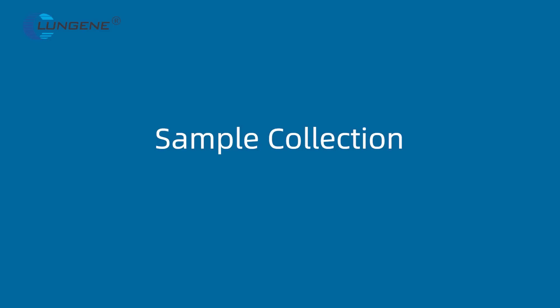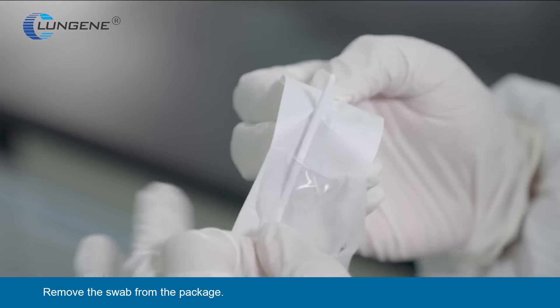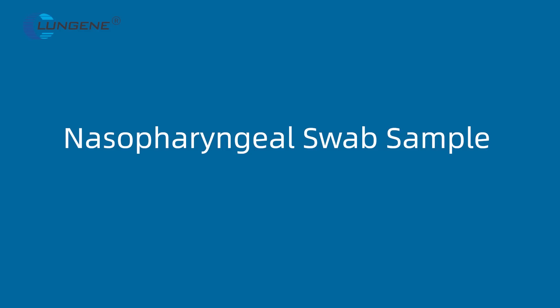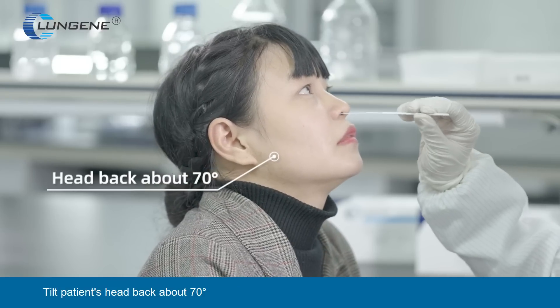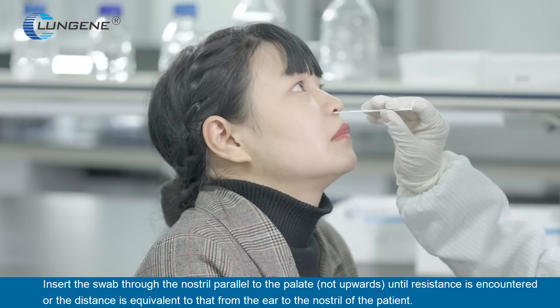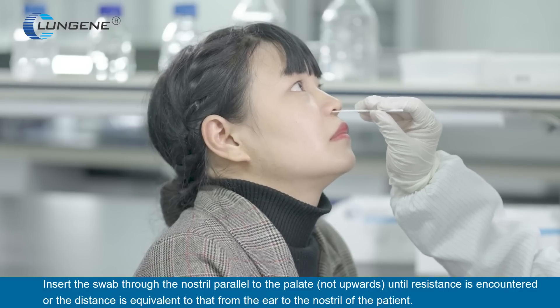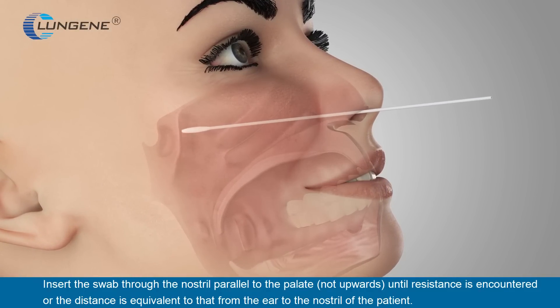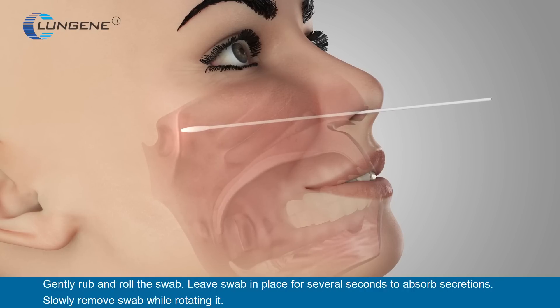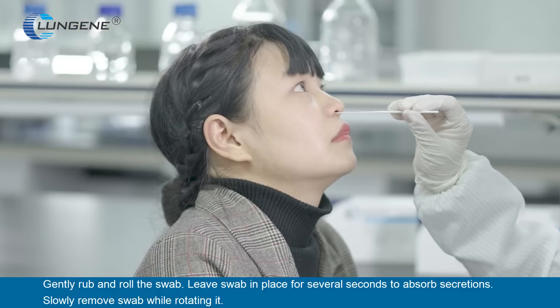Sample Collection. Remove the swab from the package. Nasopharyngeal Swab Sample: Tilt the patient's head back about 70 degrees. Insert the swab through the nostril parallel to the palate — not upwards — until resistance is encountered or the distance is equivalent to that from the ear to the nostril of the patient. Gently rub and roll the swab. Leave the swab in place for several seconds to absorb secretions, then slowly remove the swab while rotating it.